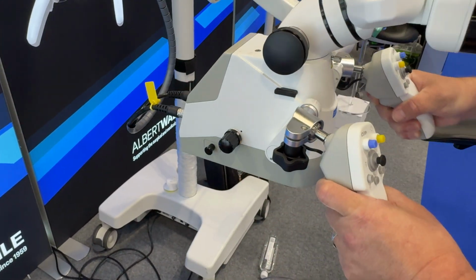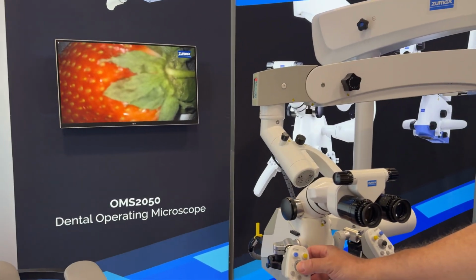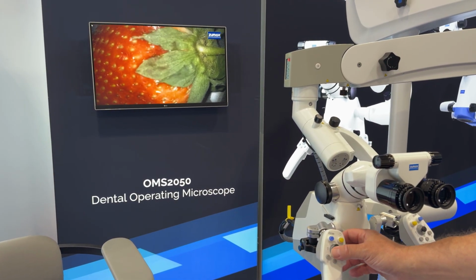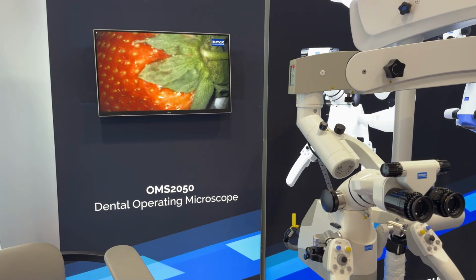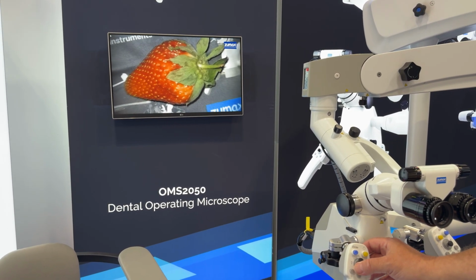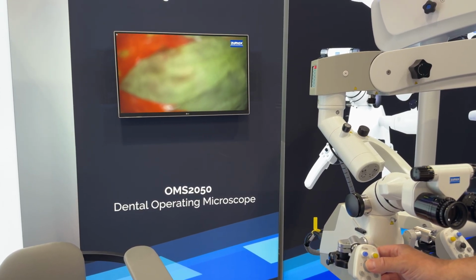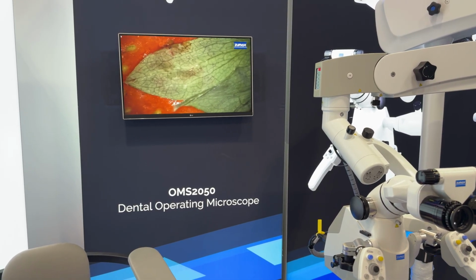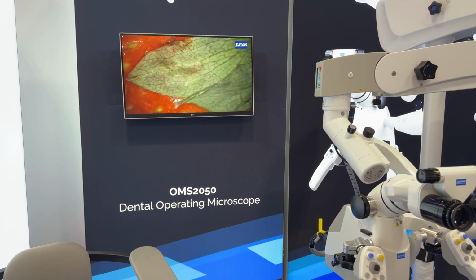So if you move that back to the object we're focusing on, which is this strawberry here, if I do my focal, you'll see that it's coming in and out of focus. Going up, you're getting into focus. Going down, you're altering your magnification there. So that's down to your lowest magnification, all the way up to your highest magnification. And as you get to the highest magnification, you might want to readjust the focus. If I'm focusing specifically on there and then I want to take a picture, I press that button, and it's taking the picture for me.